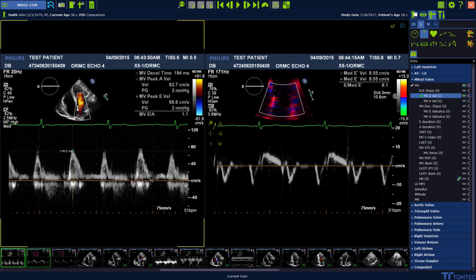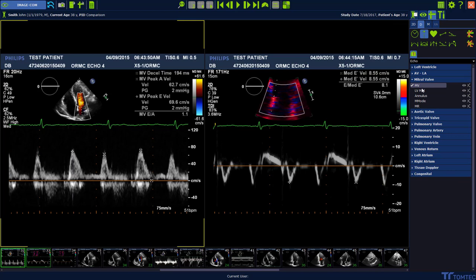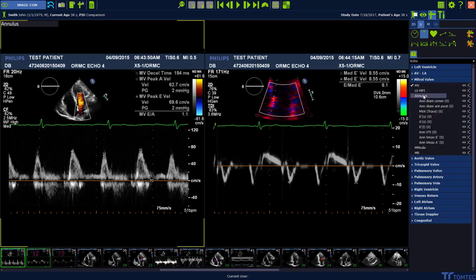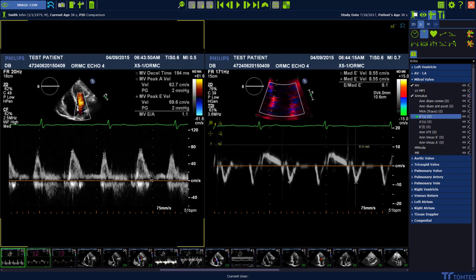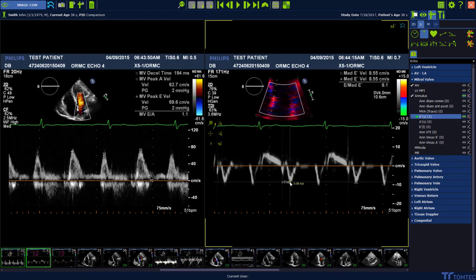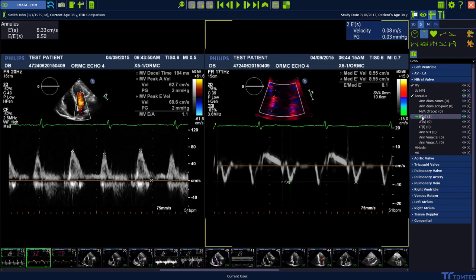Close the sub-item MV and choose annulus. Select the E prime septal measurement, move into the image and perform the measurement with a left mouse click. If you move the mouse again over the measurement package, the measurements are going to appear in the left upper corner.